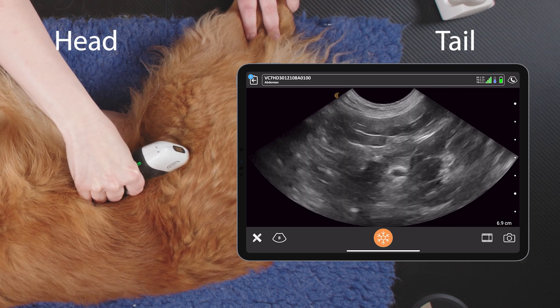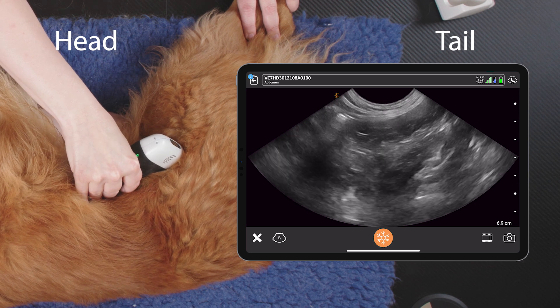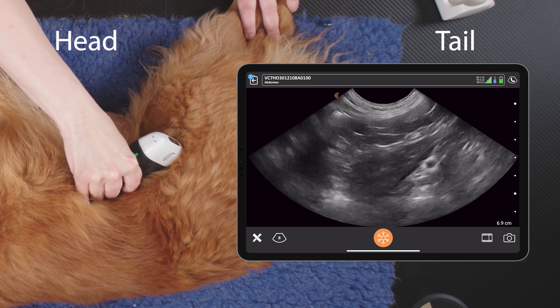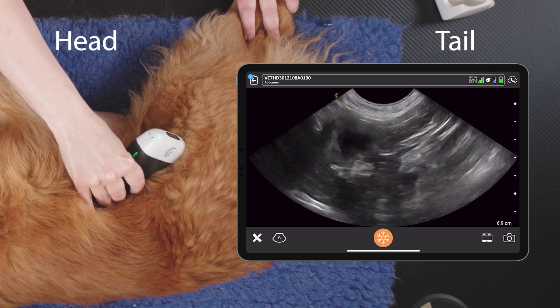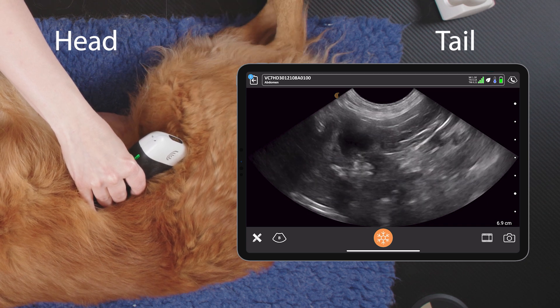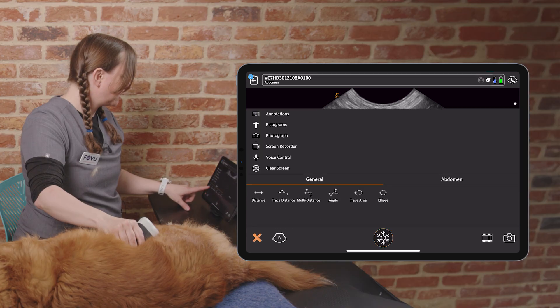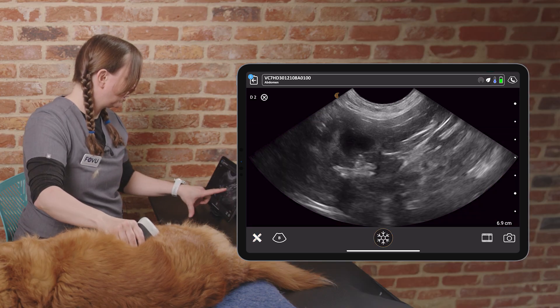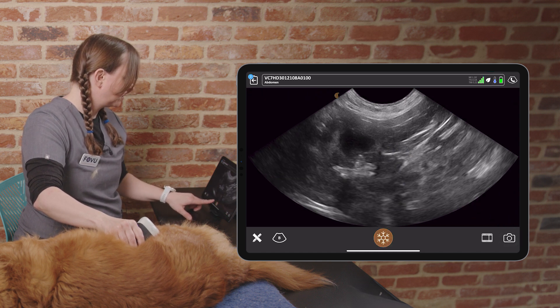Just following and fanning in this region, we can see the caudal vena cava there still. And into our view pops the right adrenal gland. We can take our caudal pole measurement here, like so.